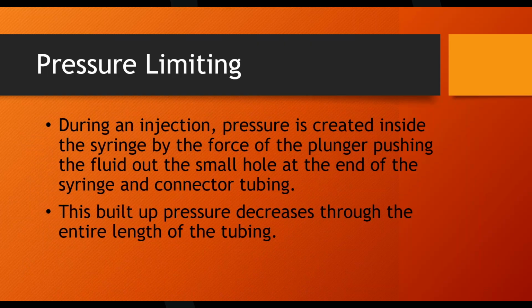All right, so I told you it's been a while. My timing is off. So let's say this is my patient. We're all set up, and when we fill the syringe up, this is referred to as a fill tube, and this goes on here like that. Then you're going to have some container of fluid, contrast or saline, and you put the bottle up there, and obviously this has to be drawn. This will go all the way to the top first, and once it's drawn up, we'll reverse it, pull the fluid into it, and now my syringe has fluid in it. And same thing on the contrast side.